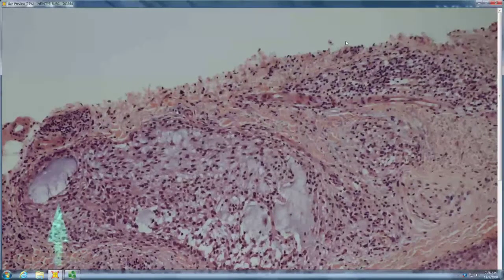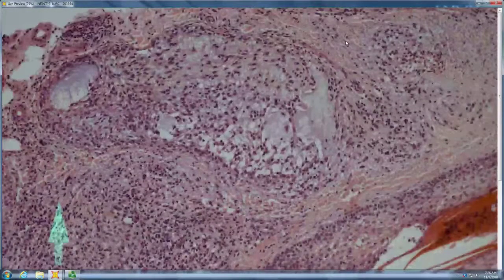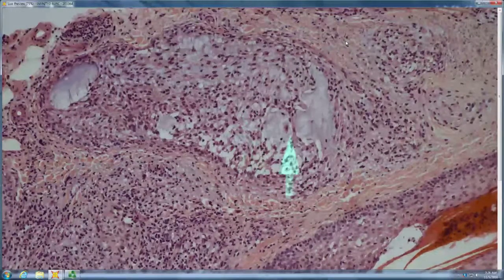But early alopecia mucinosa, its course is probably better defined by the clinical presentation. So young person, boggy plaque, likely not to be MF. Older person, more widespread, bigger than your palm, limb girdle area, poikilodermatous over time is likely to be MF. Okay. And all of this blue stringy stuff is mucin. So when you see that, then it's not hard to make the diagnosis.